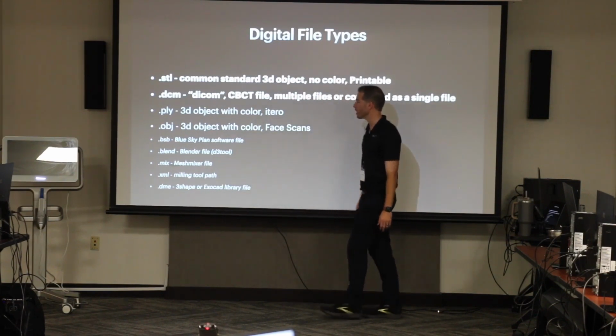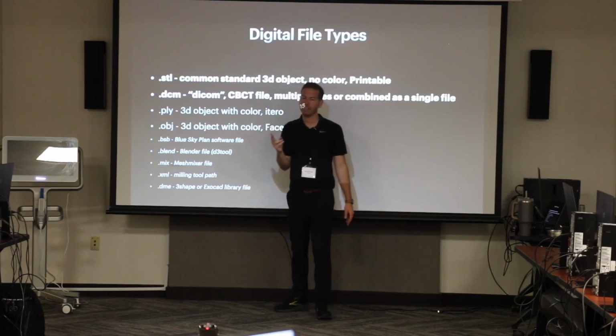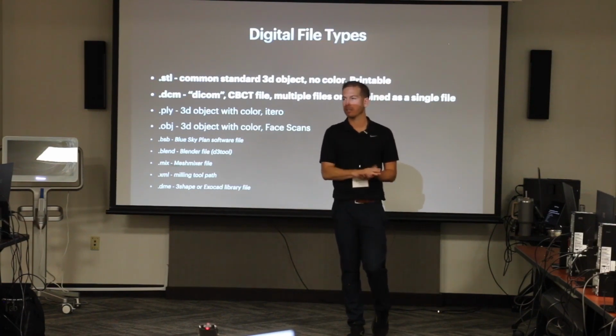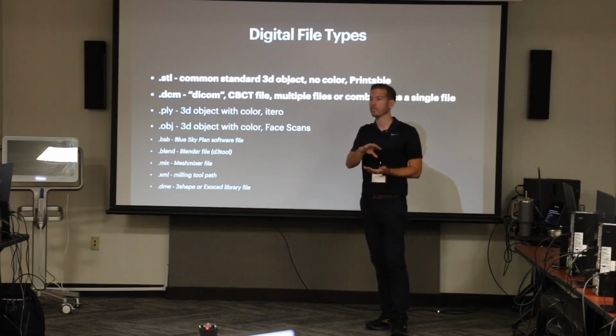So think about that. All the different softwares that we use have their own file types when you save them, but you're saving them as a file that's referenced to that program, not a universal STL. So just remember that. Think export, not save. We want to save our work, but when you actually want to go use it, we got to export it.